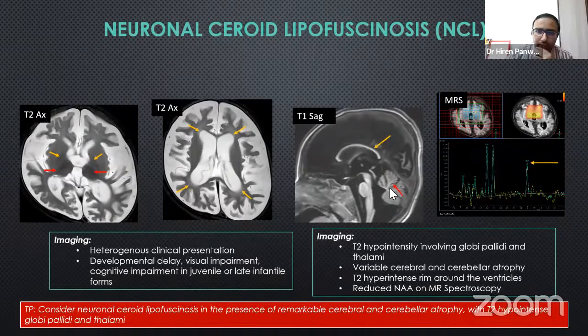So if you see this particular image, ideally the superior vermis starts from the collicular level and it should end at the level of the obex in a normal population. So if you draw a line from the obex and the vermis is not reaching up to that level, and if you see some interfoliar space widening, as seen here, then you can call it vermian atrophy.